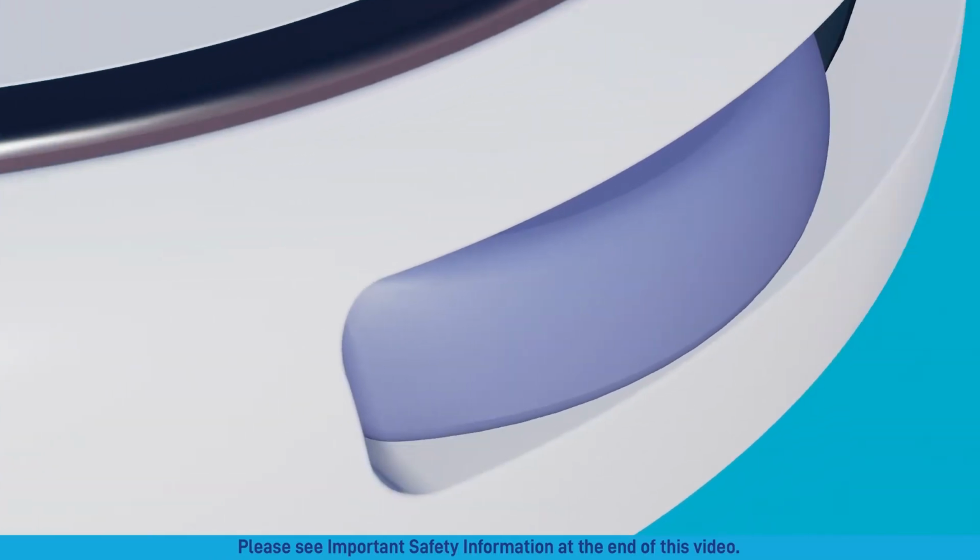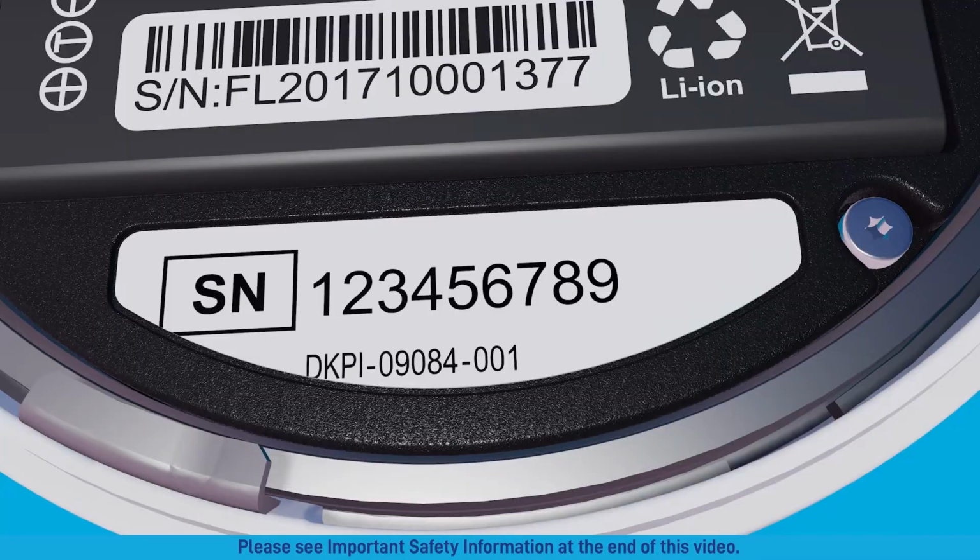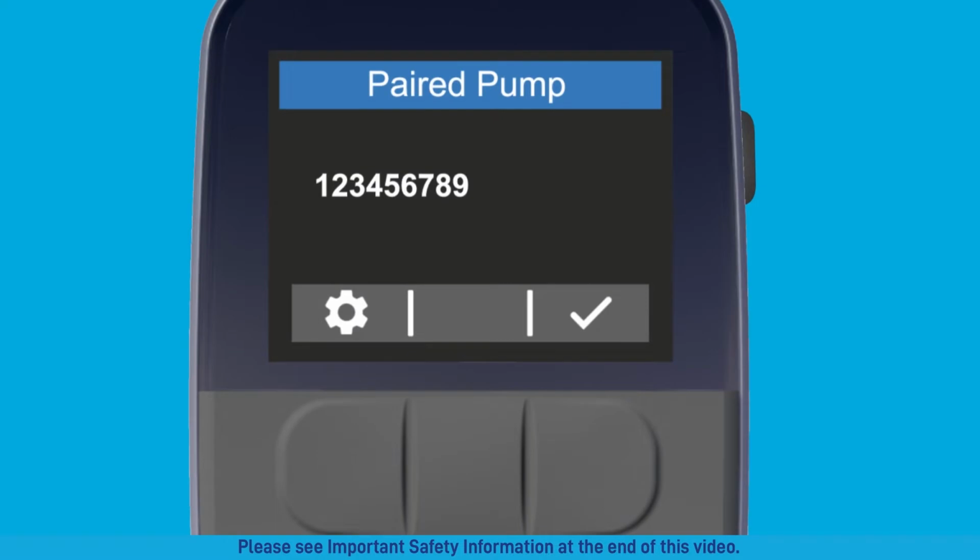If that doesn't work, make sure the pump is not attached to the cassette, and then press and hold the blue pump button for 10 seconds, even after the pump beep. After holding the pump button for 10 seconds, you should hear another beep. Make sure you've selected the correct pump and serial number. If you're still having difficulty, attempt to pair your remote to the spare pump and call your specialty pharmacy for further assistance.